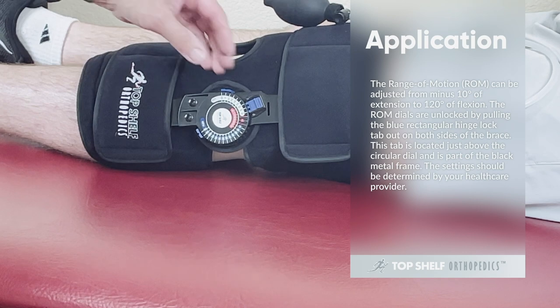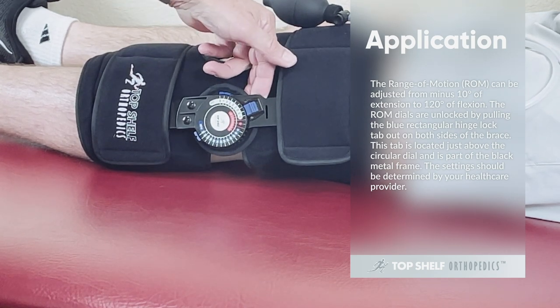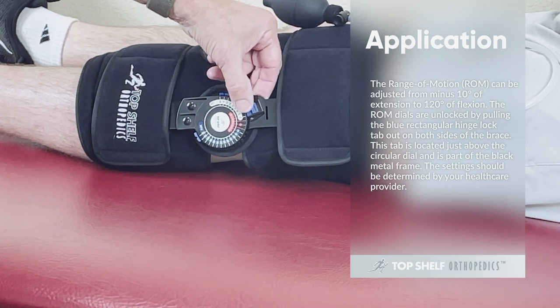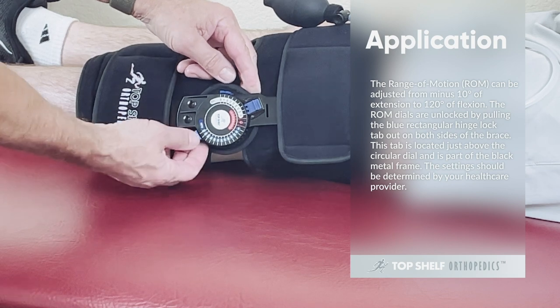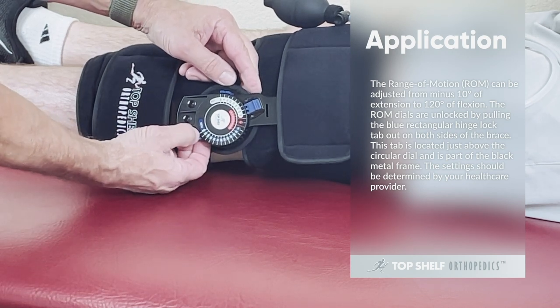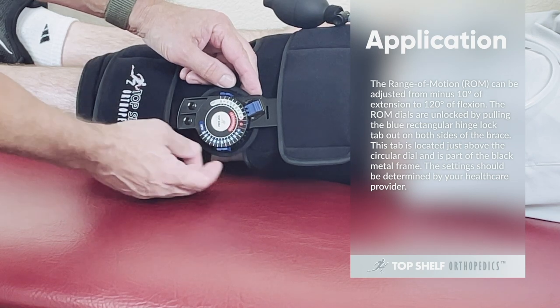The range of motion can be adjusted from minus 10 degrees of extension to 120 degrees of flexion. The range of motion dials are unlocked by pulling the blue rectangular hinge lock tab out on both sides of the brace. This tab is located just above the circular dial and is part of the black metal frame. The settings should be determined by your healthcare provider.